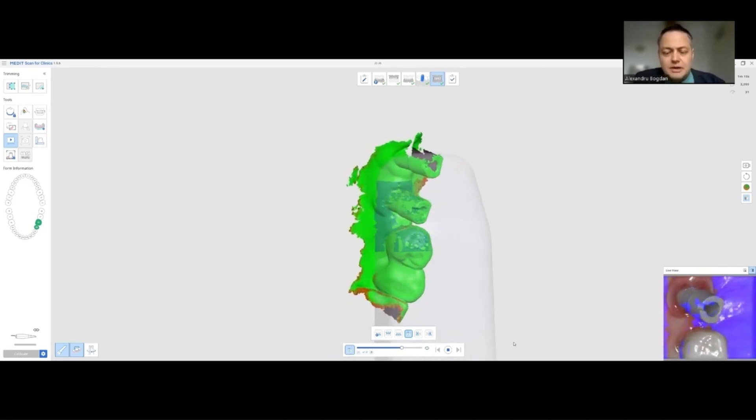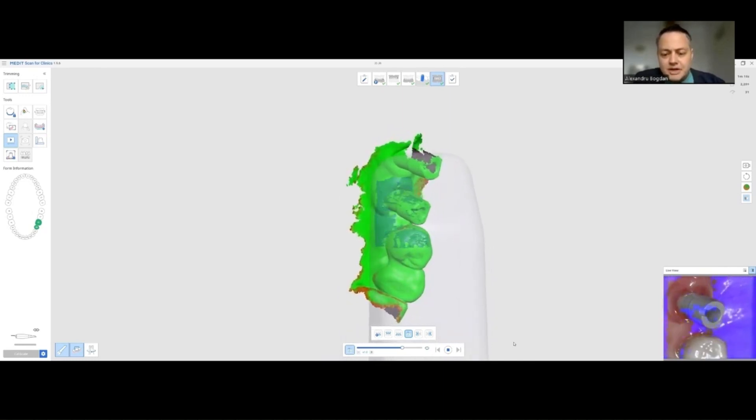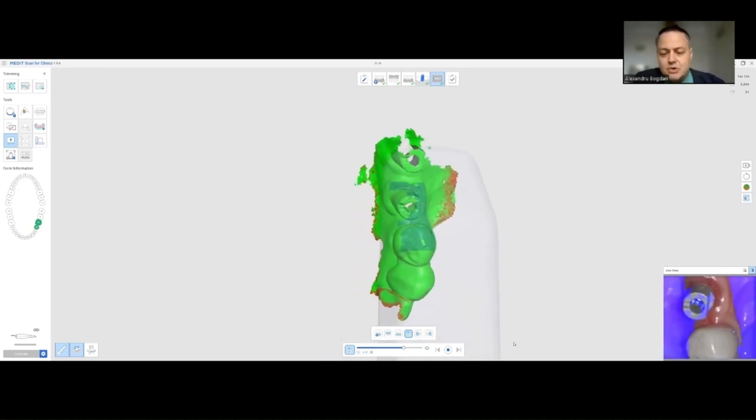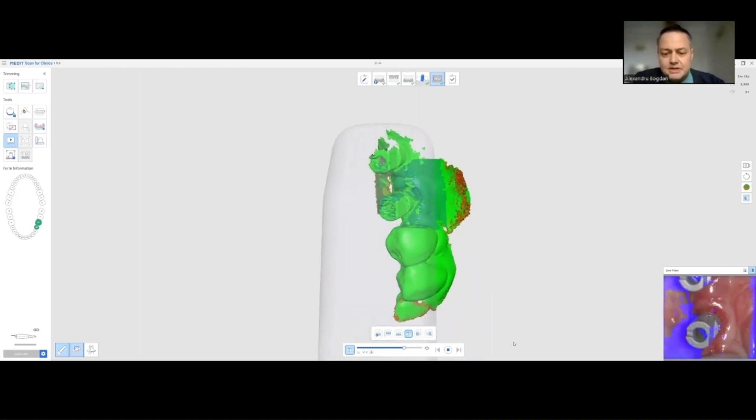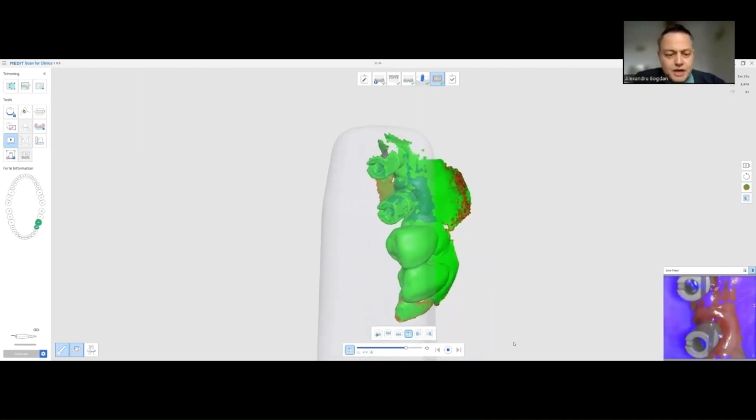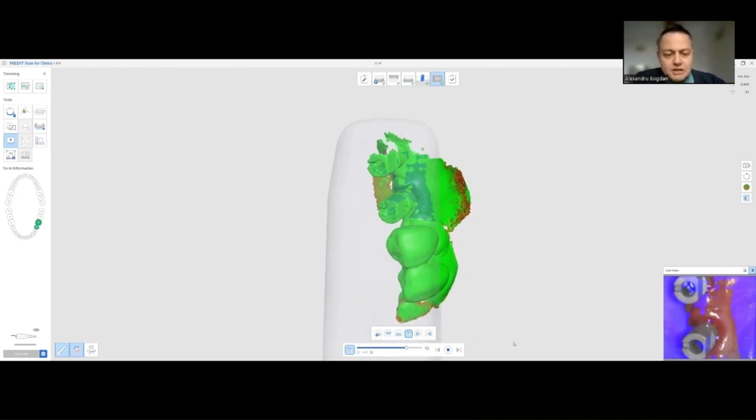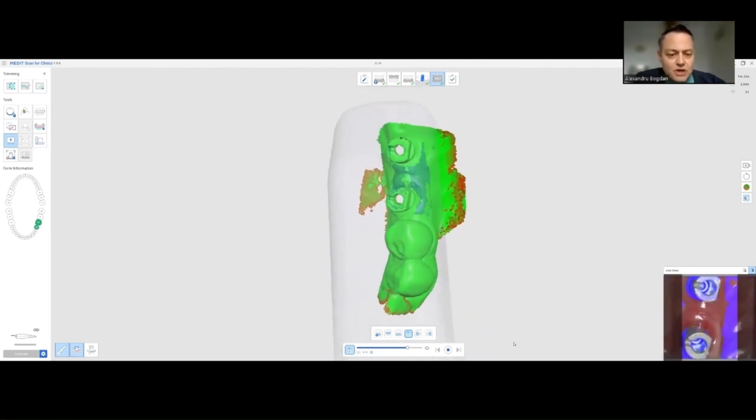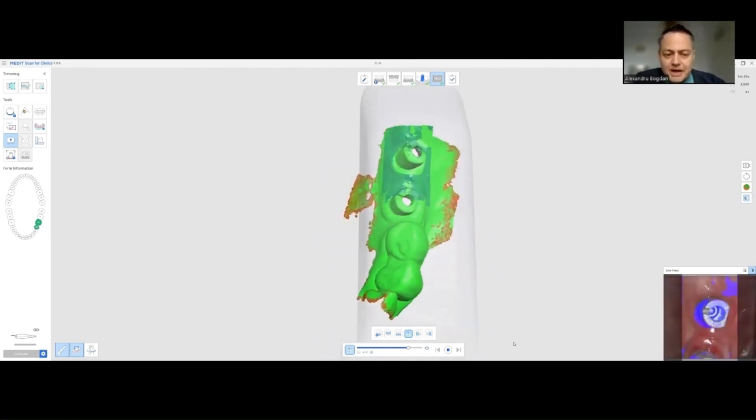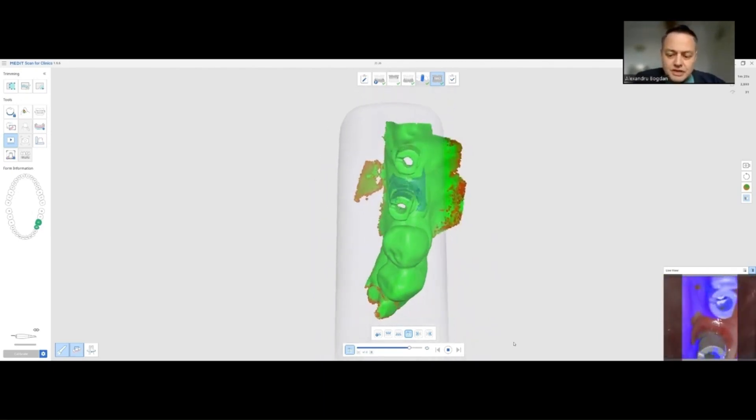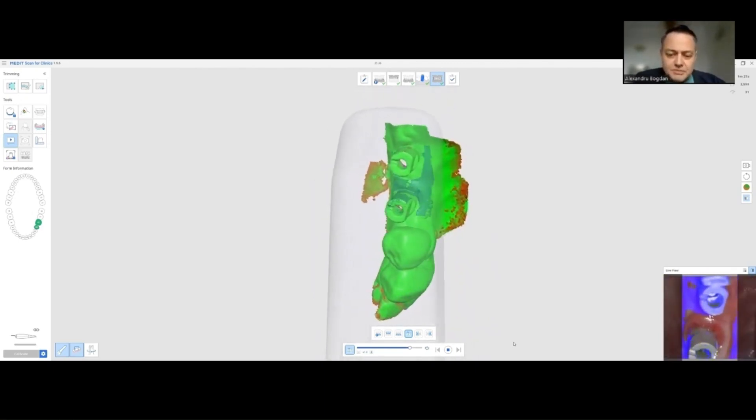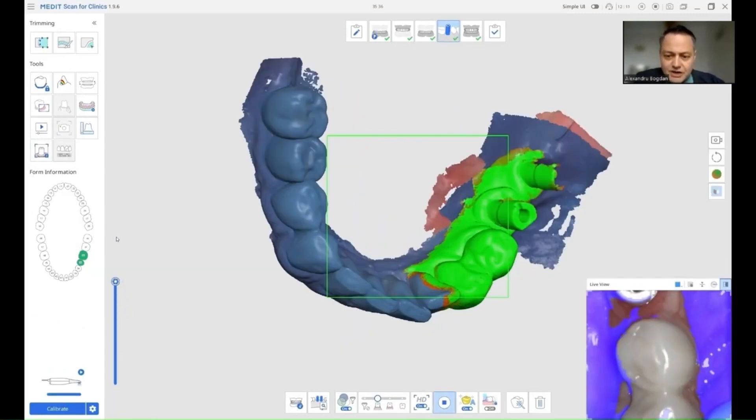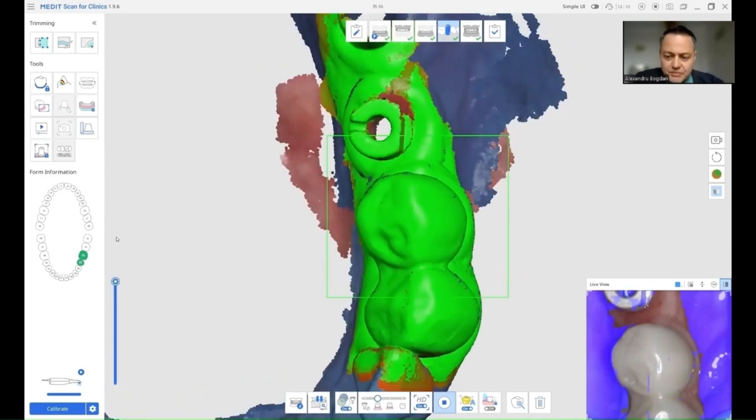Imaged by the HD function that gathers many more points than the SD function. Also, I like turning the focal distance to the max so that I can get as much information as possible in this stage and as far away as possible.